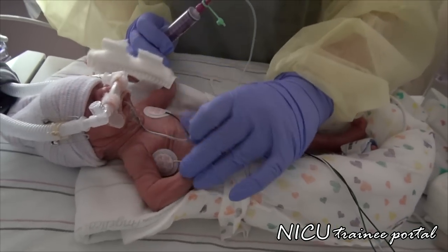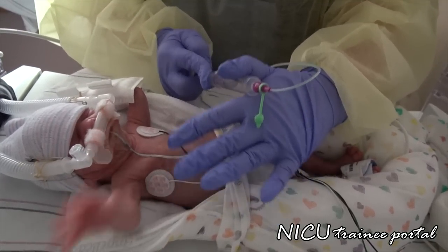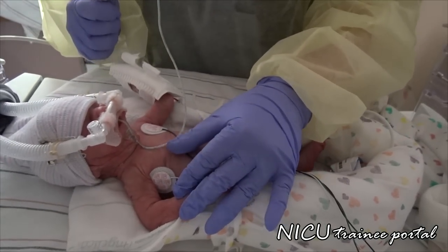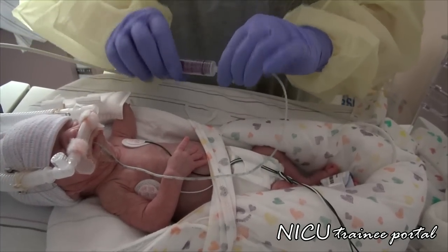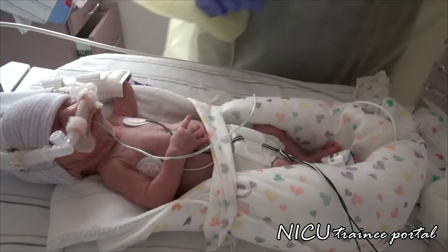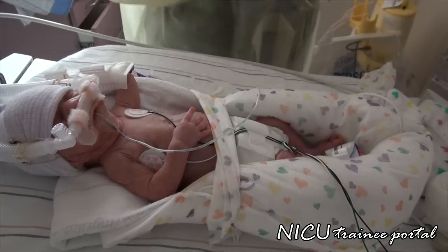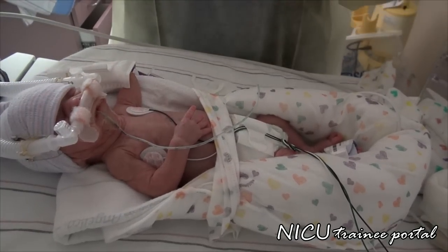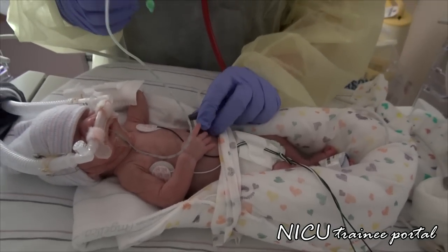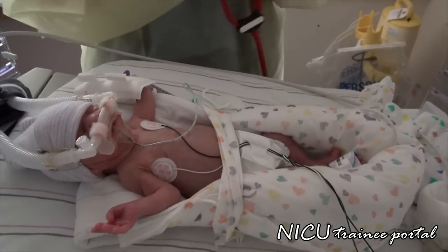Once your tube is in place, try to aspirate some gastric contents. If your baby is on CPAP or non-invasive ventilation, you will get quite a bit of air out of the stomach. You can see the gastric contents coming up through the tube. Placement can be checked a couple of ways — we use auscultation. Be careful if using H2 blockers or proton pump inhibitors as they will alter your pH. We're going to inject 2 cc's of air into the stomach and listen for placement. You'll hear a pretty loud bubbling. The tube is in place and is now ready to be used.